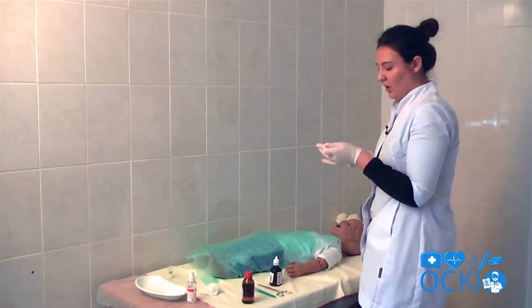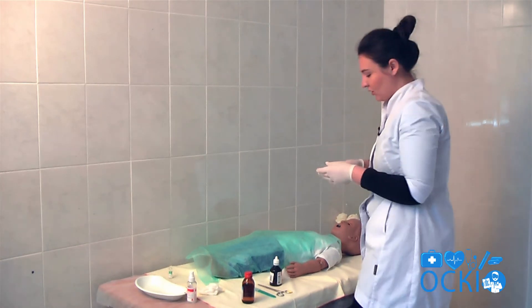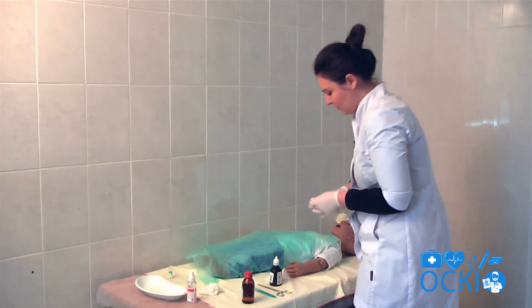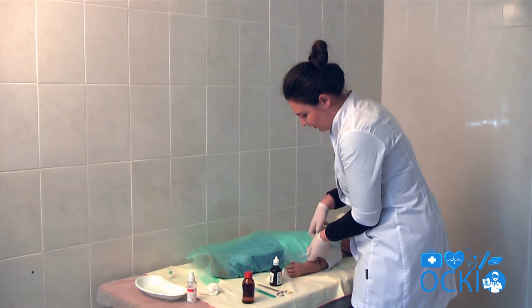After that, puncture the cavity of the abscess to obtain purulent content.